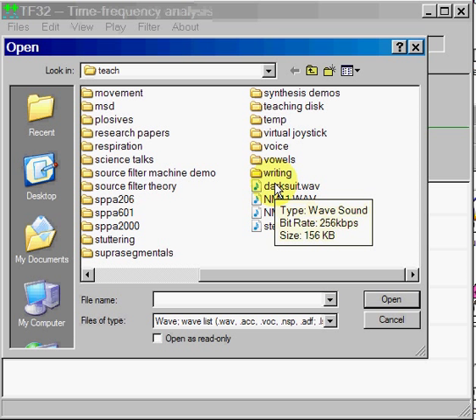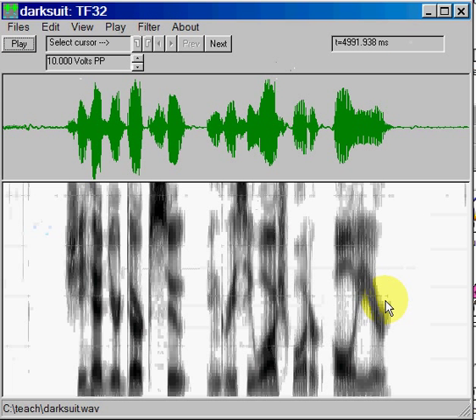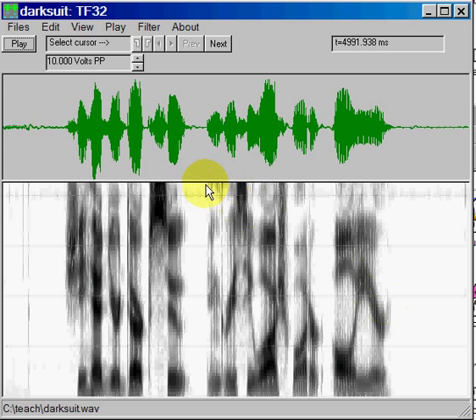In this case I'm going to select a file called darksuit.wav. If you hit Open, you can see that we have a two-panel display. The top panel is the sound pressure waveform in green over gray, and below the black and white image is a wideband spectrogram.